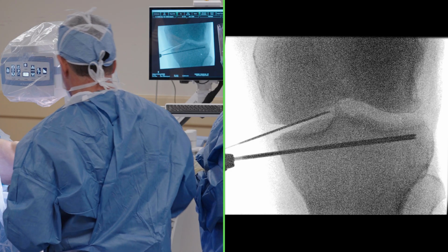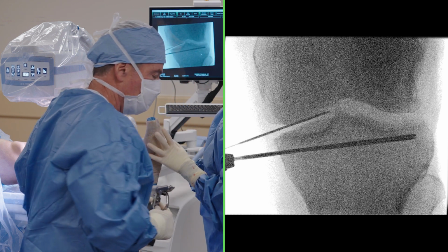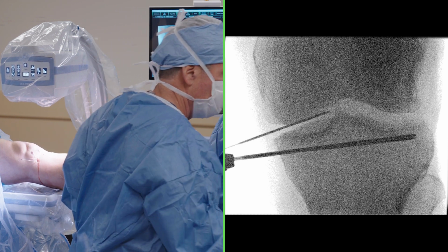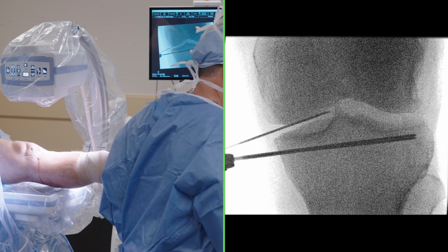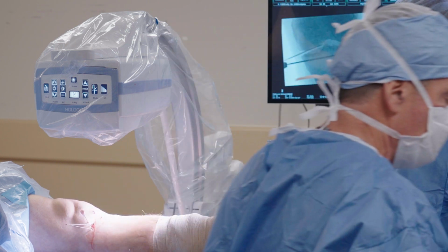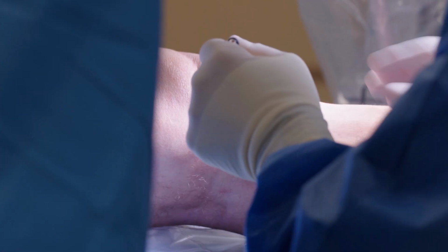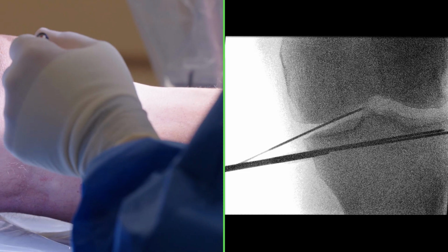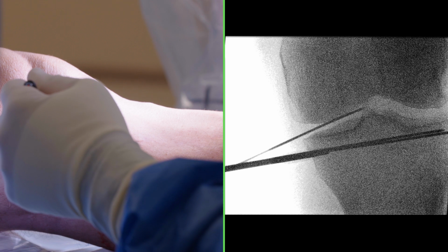I'm getting a rough idea that we're collinear and that we are on the opposite cortex, but the cannulated drill will help assure the opposite cortex. 11 blade. We can actually take one measure now with the indirect ruler just to get a rough idea of where we're at. For the anterior one, I just want to make sure I'm generally on the, yep. Because it's triangularly shaped, it looks like it's through the hole, but it's not. So this is 65.